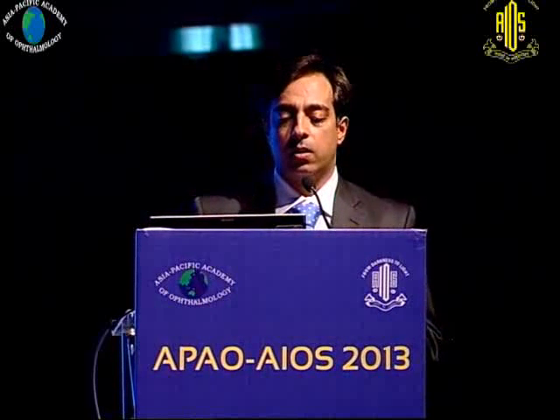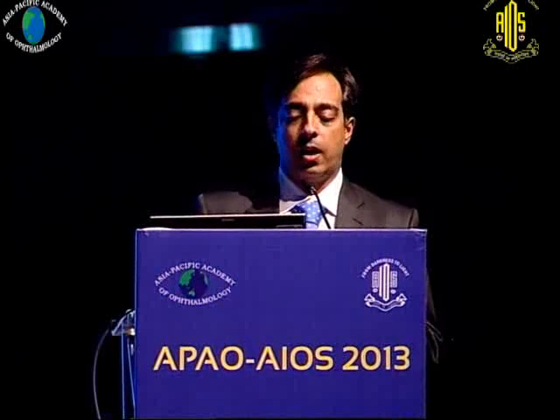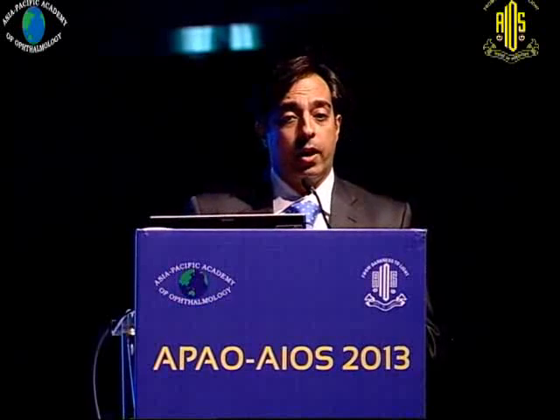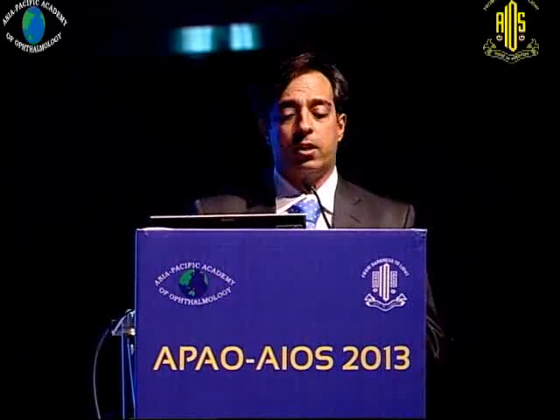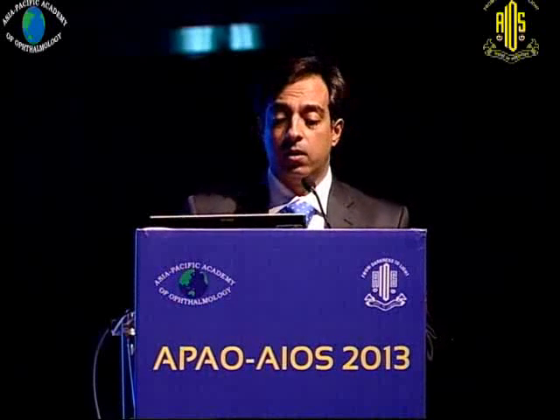So make sure you scan the inferior periphery in such cases. Carefully look at them. If you have the slightest suspicion, like we saw in this case, make sure you laser barrage that whole area, and of course the vitreous needs to be removed from there, so that the chances of a detachment become less. Macular holes are notorious for these inferior breaks which can form.